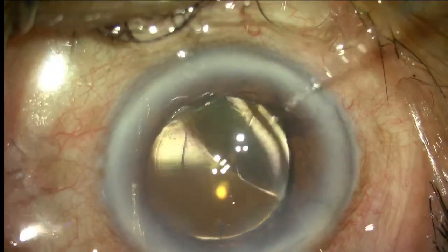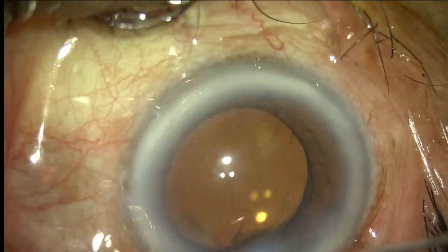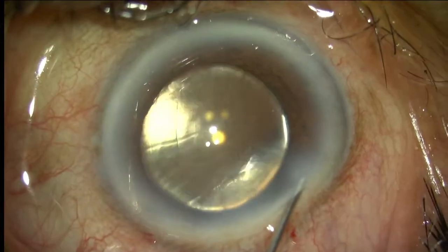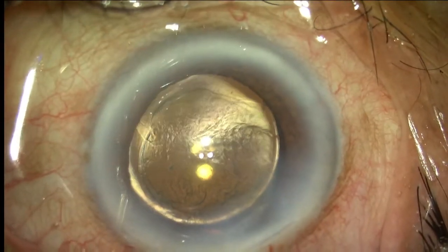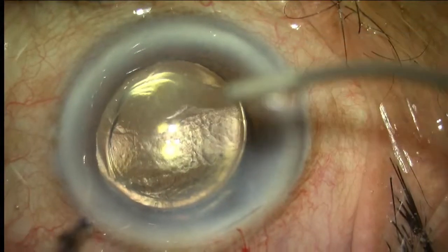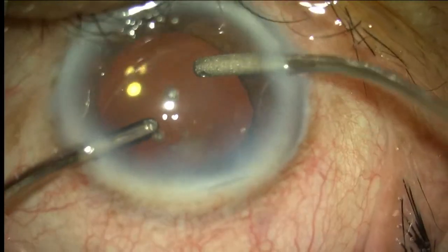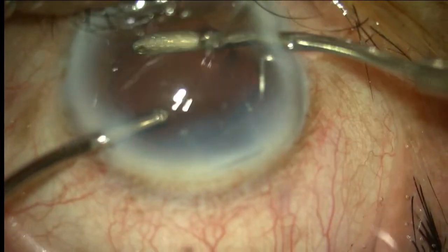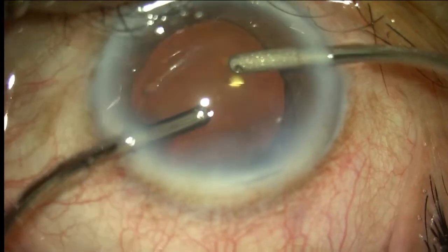So Rajesh, anything you want to ask about the lens? It's basically a spherical aberration based IOL. There is a manipulation of the spherical aberration on the anterior surface of the lens. And as you have seen, the injection system is beautiful. The lens is a hydrophobic lens and beautifully incarved. The surfaces are beautiful and the edges are square, C loop.